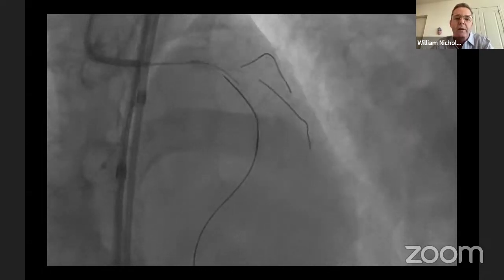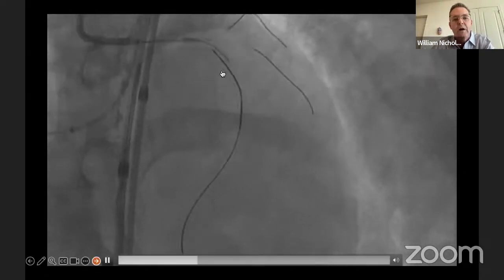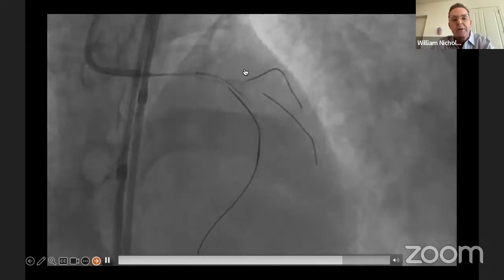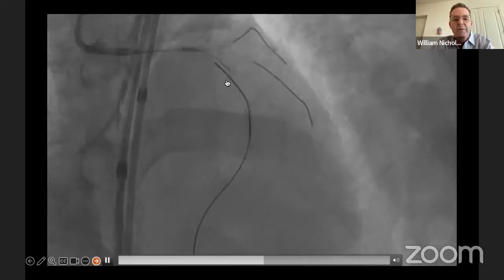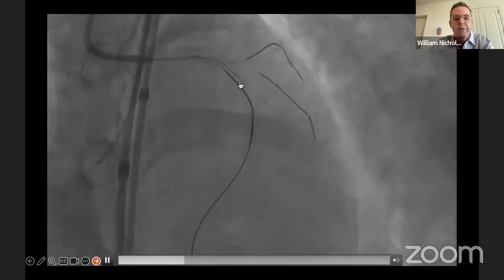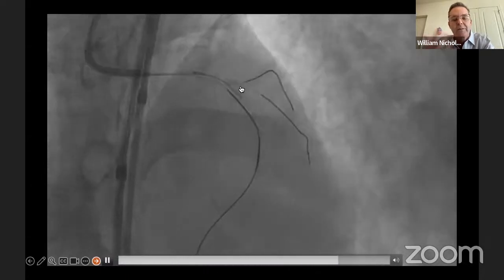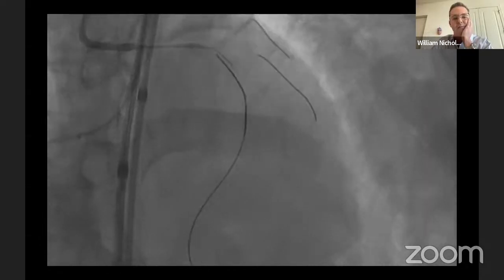So I don't know where that cap takes off. I know my antegrade wire here, unfortunately, is not true lumen, so I'm not going to see the cap by doing IVUS. So I don't have a good way of overcoming this. So to me, this becomes more luck than skill, and I'm not sure if anybody really has the answer. I'd be curious if you have any suggestions of what you would do to not press forward with capturing the LAD, knowing that you have a significant chance of never getting access to that diagonal again.